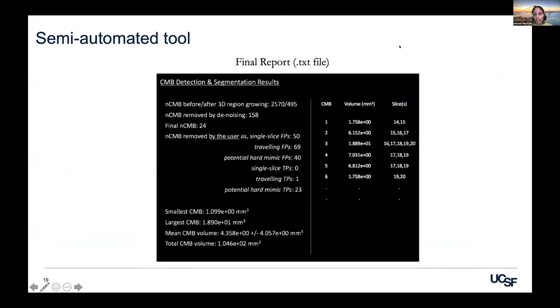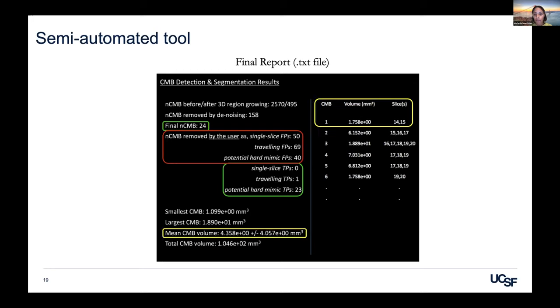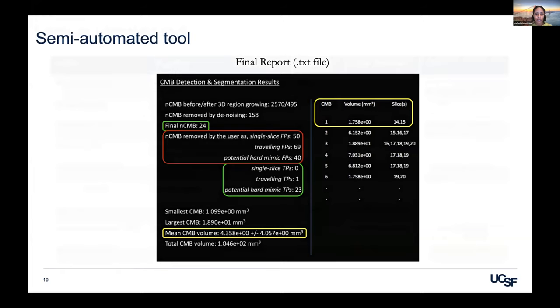The final portion of the tool generates a text file report. This highlights the final number of microbleeds, how the user classified them — for example, if it was a traveling vessel but still classified as a microbleed. It tracks all false positive information, mean microbleed volume, and every individual microbleed's size and the slices it occurs on, allowing manual modifications to segmentation if needed.